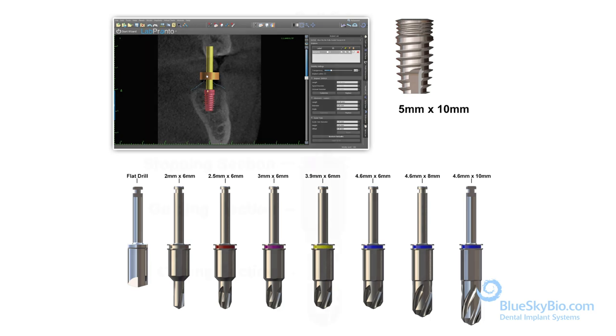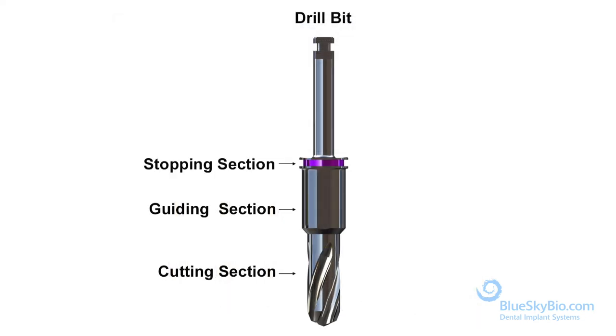The drill bit consists of three parts: the stopping section, the guiding section, and the cutting section.